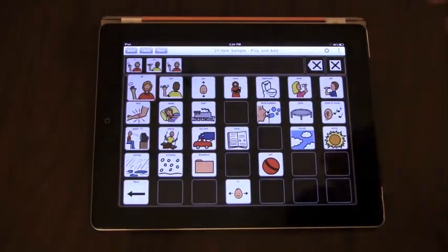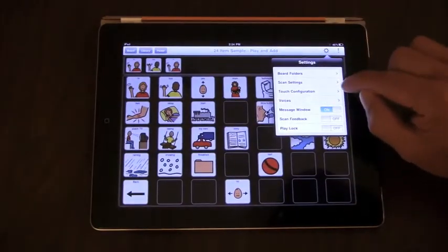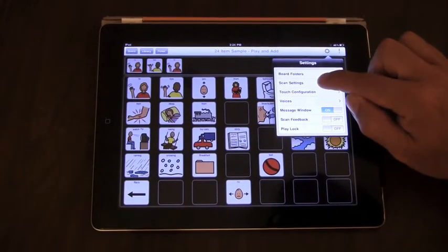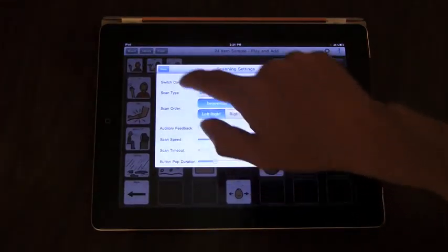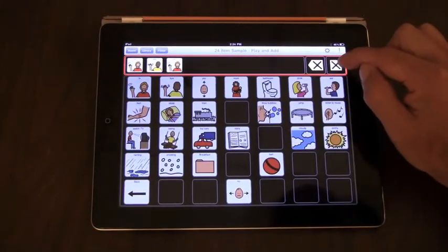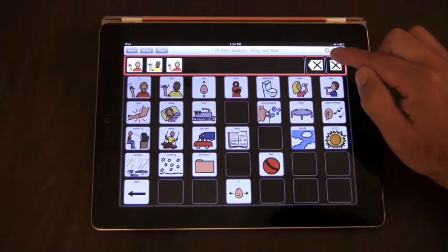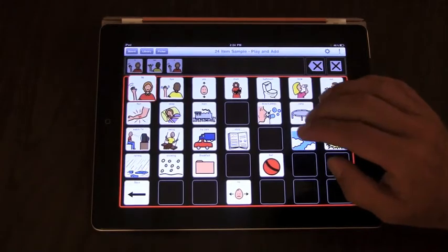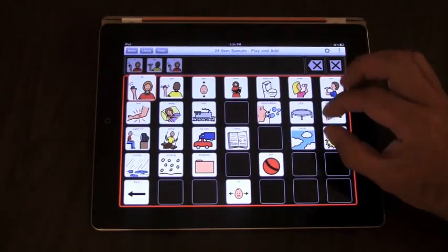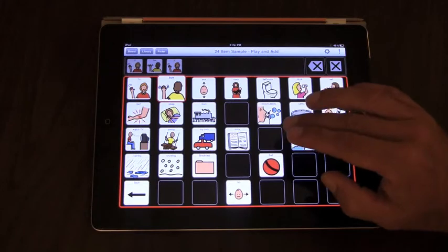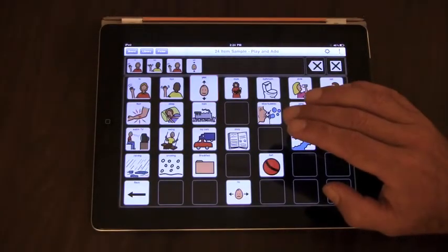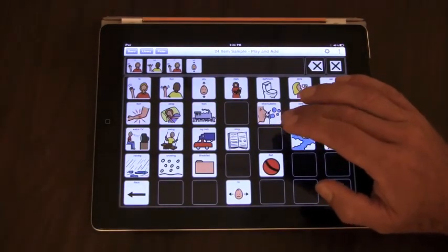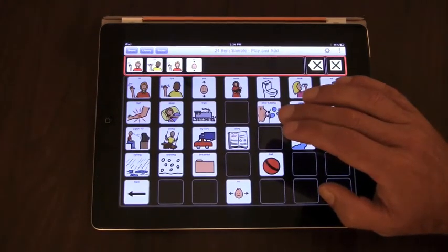If we want, we can turn off all feedback and just have the visual on the screen of the message window highlighting, the board highlighting, and then an expansion or the pop of each button as we scan through each button. And when we select a button, it will speak the button. And we can now speak this sentence.